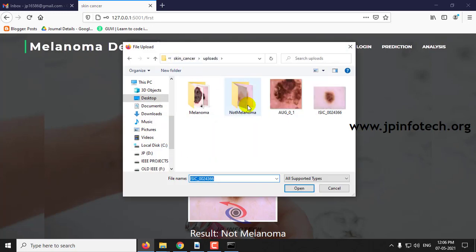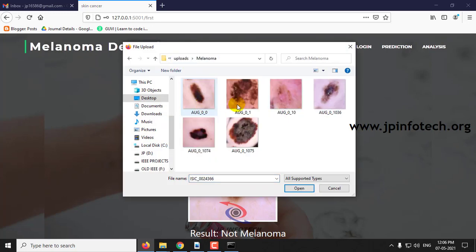You can check with any other cases also. It is not limited to only these images.